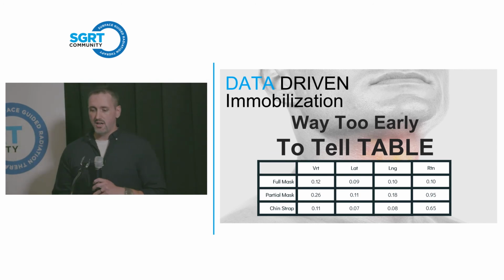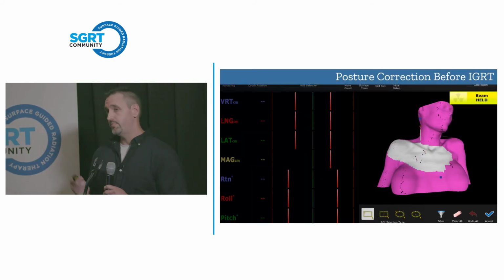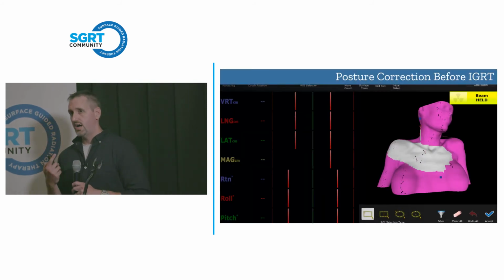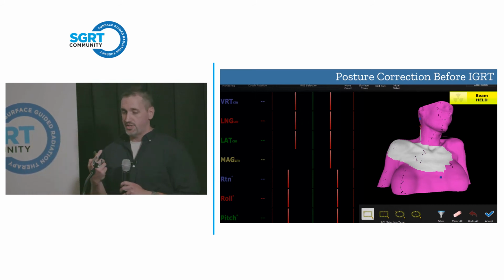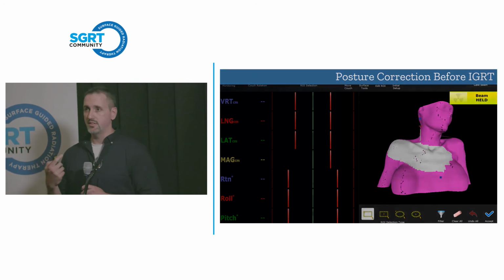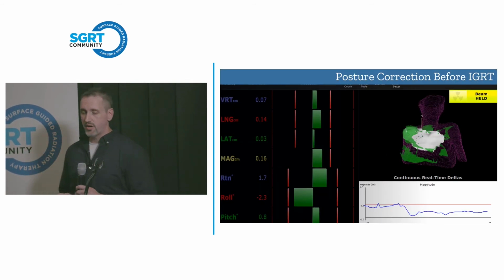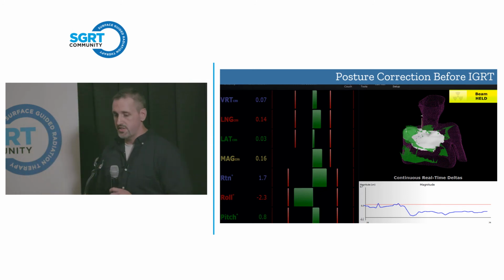The next thing we look at is patient satisfaction and patient safety. This patient is a lymphoma patient. This patient had been hit by a car, so she has pain issues, a bad neck and spine. She has a frozen contralateral shoulder. She has a very large breast augmentation and presented with a lymphoma mass that traveled from behind the ear on the outside of the neck down into the axilla, requiring a VMAT delivery to spare the amount of lung volume that would have been required to treat this patient.